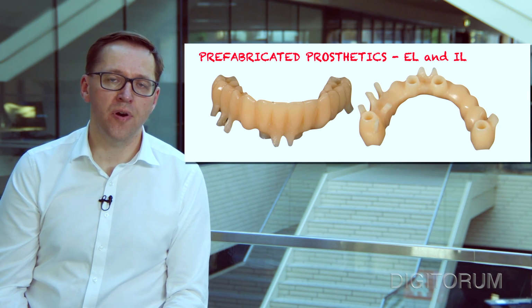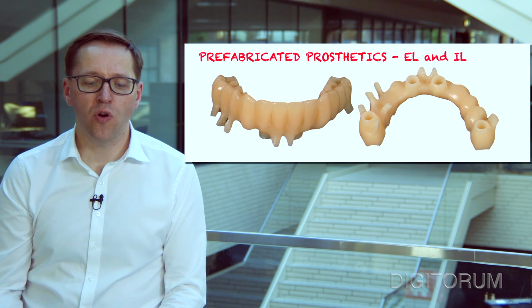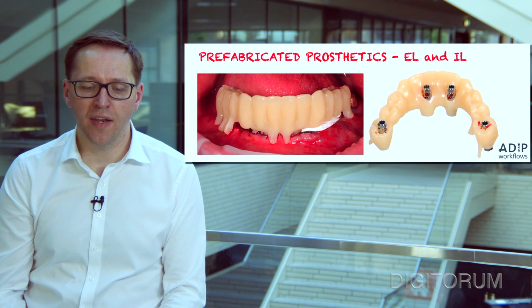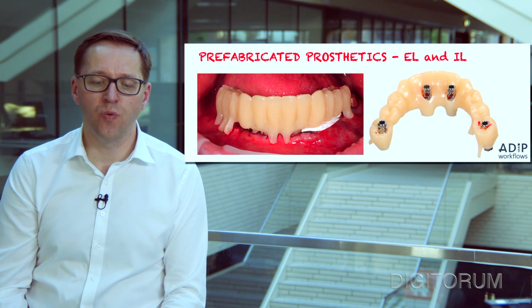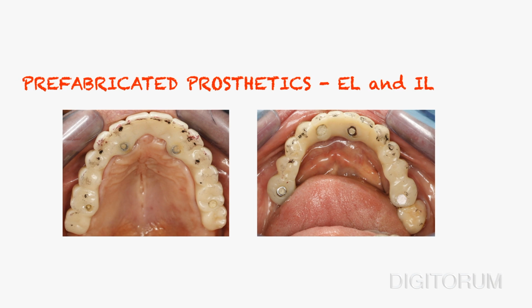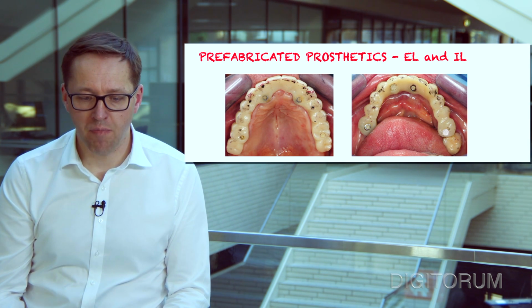And again, pre-surgical prosthetics were milled with some support legs to stabilize the PMMA bridge during the relining procedure. So right after the implant placement, we proceed with a relining of the PMMA bridge, and the patient is immediately loaded, and has an early loading in the upper arch with temporary restorations. And there's no surprise that of course, we have to adjust occlusion. Not everything is perfect.